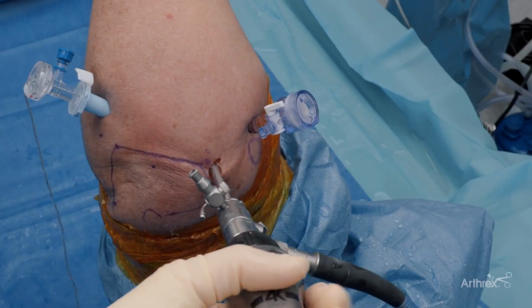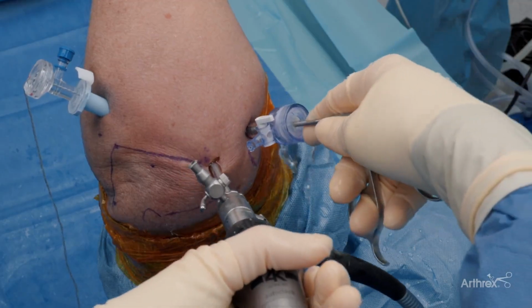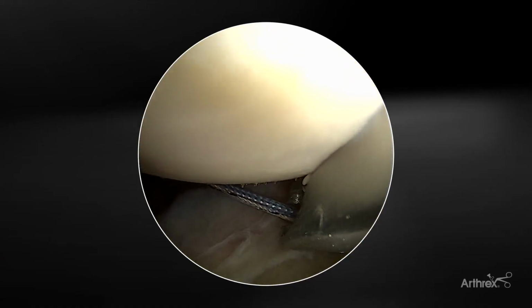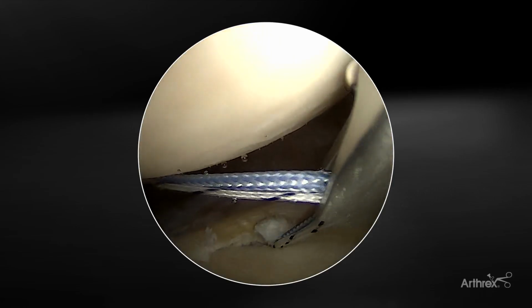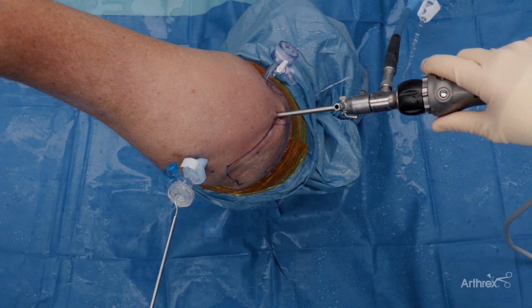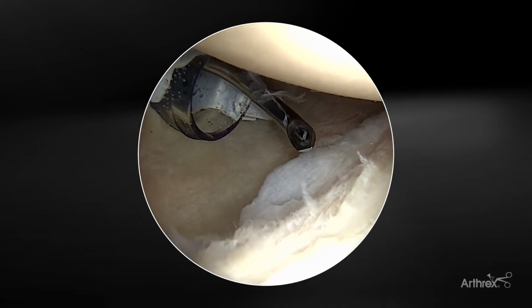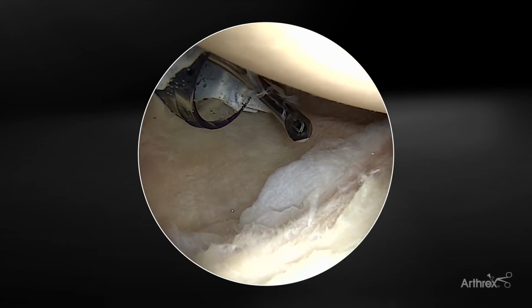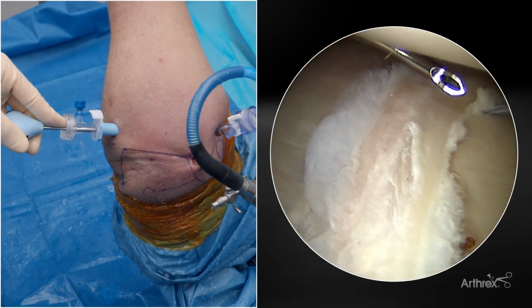I'm going to take the mini kingfisher. I like always getting these out of the way, and so I take an extra step and shuttle these out of the way before I start with my first pass. So I've got those all now out my anterior cannula. So I'm going to use a 45-degree suture lasso. Arthrex has a lot of options that we can use here for our suture lassos. The 45-degree ones will pass through a 7mm cannula. This just really helps me get the angle here.